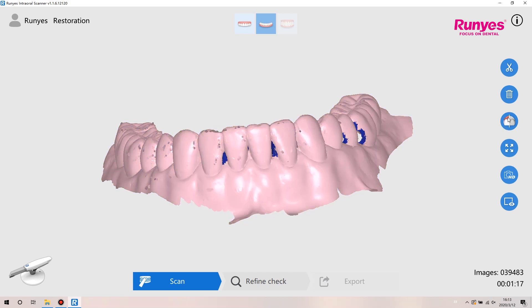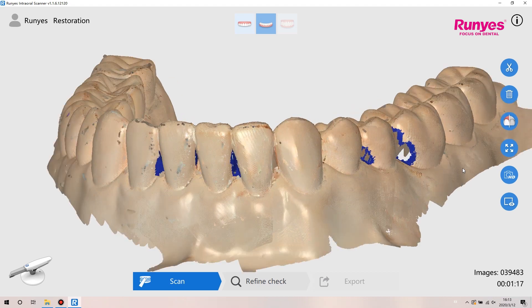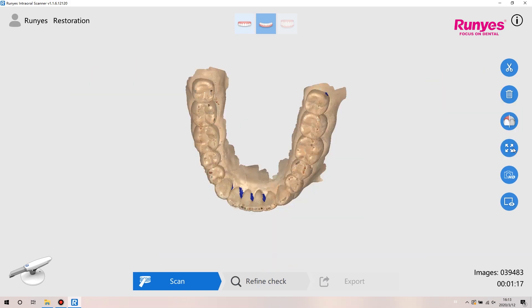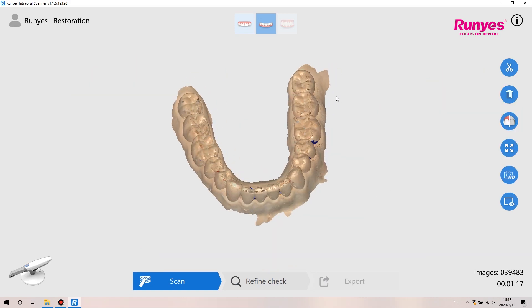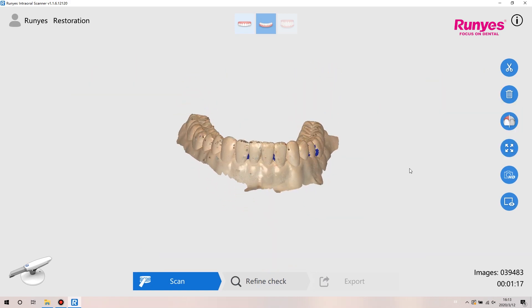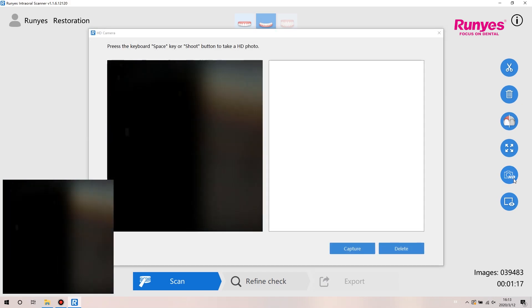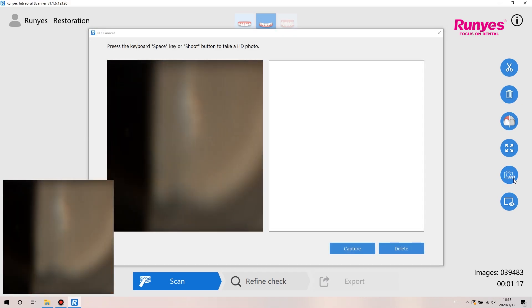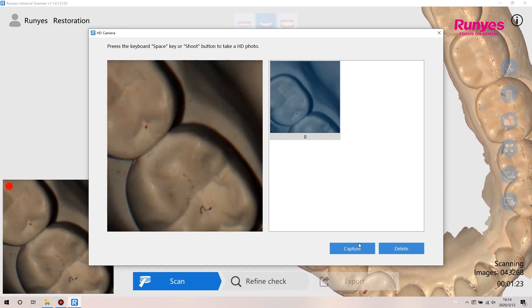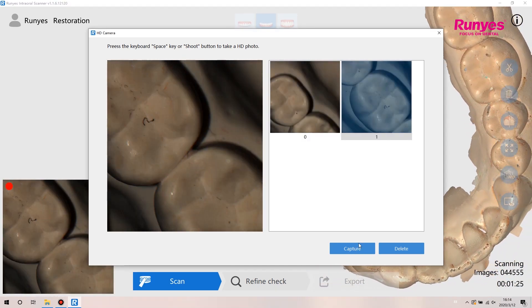Click the true color button. Users can choose true color or non-true color display. Colors can be selected in the settings interface according to the user's preference. The zoom fit button can make the scanned 3D model return to the middle of the screen. For the HD camera, users need to open the scanner, click space or capture to take photos. Photos will be saved in the patient file.